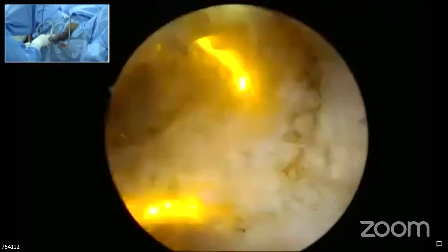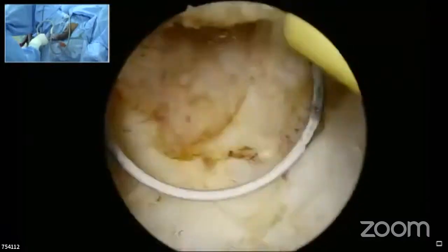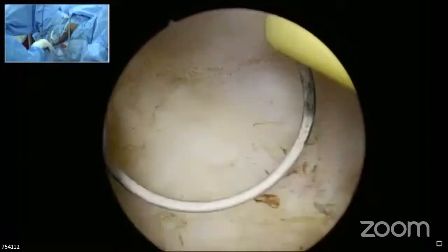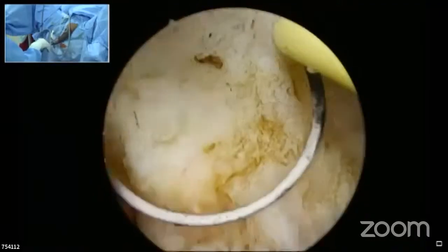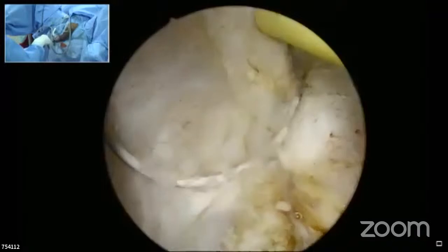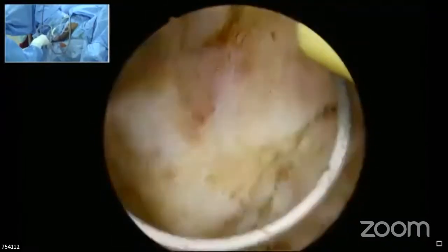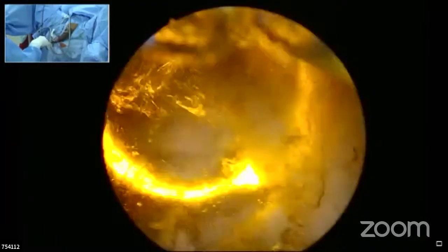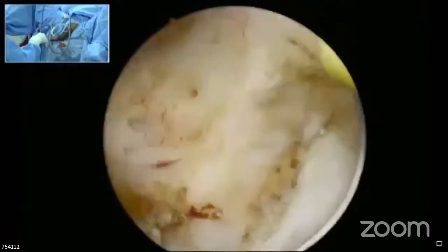And every time you don't have to see the verumontanum to orient yourself. Yes. Once you've seen it once, you can orient yourself without seeing the verumontanum. That's exactly it. Your left hand should be telling you whether by any chance your resector scope has come out of the place where it was stationed till that time. In that case, you need to orient yourself. When you are sure it is stationed at the same point, you don't need to orient, as Dr. Kripekar was talking about.